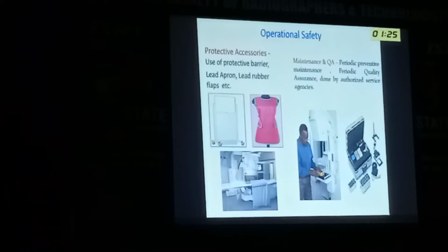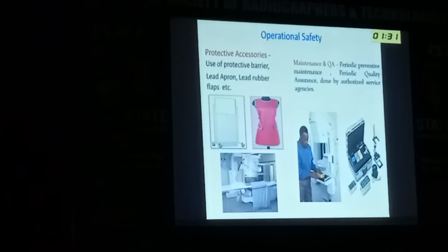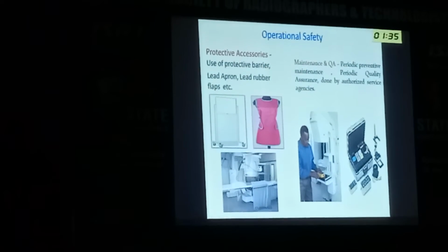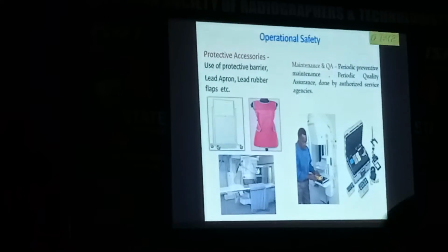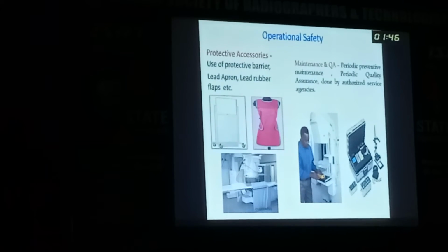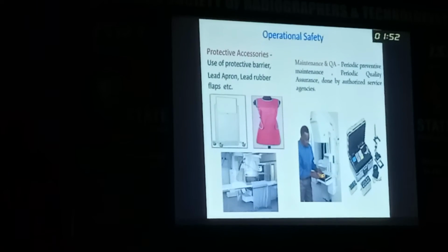And there are some definite guidelines already sent to the facility or user regarding proper handling of this TLD. It is sometimes seen that one batch is used for a few quarters. It should not be done. It will create an unnecessary amount of dose. And TLD badges should be handled properly. They should not be kept in the radiation area. They should always be kept away from the radiation area. Otherwise there will be some false information that people are getting this amount of dose but actually he does not.